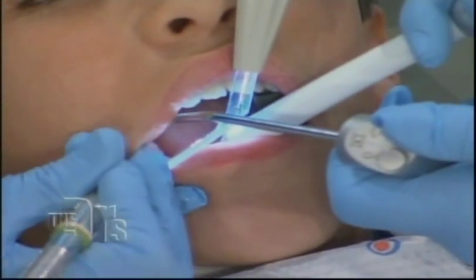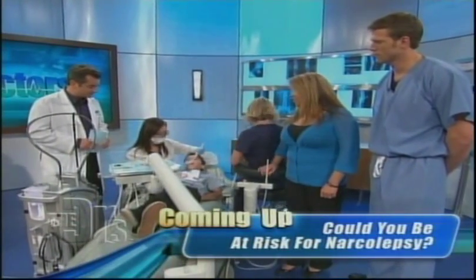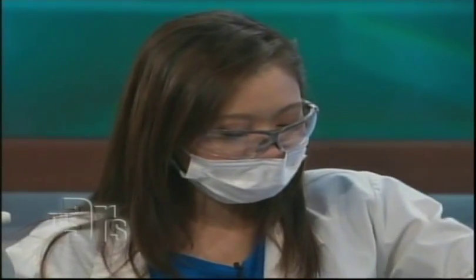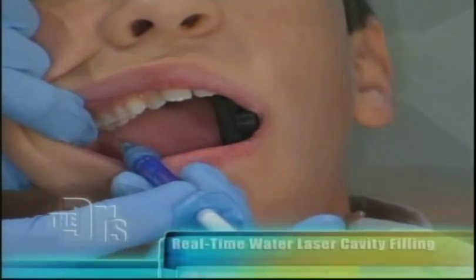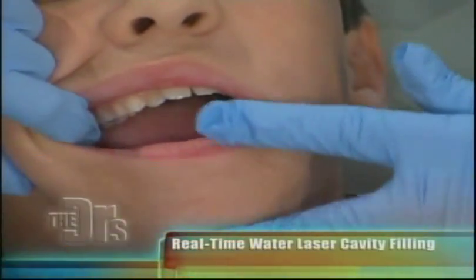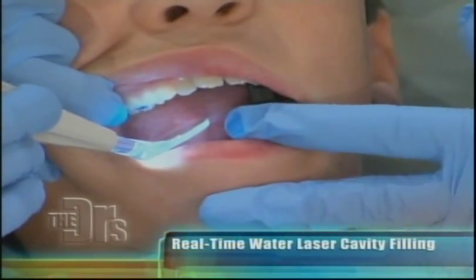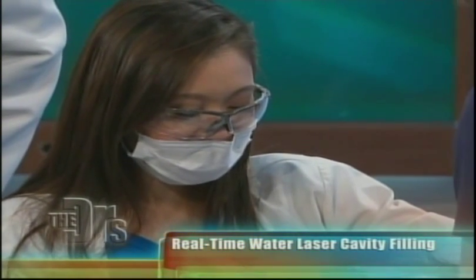Okay, so all the cavity is gone — now I have a rock-solid hard tooth. Now we're halfway done. The bad part's gone, and now we have to seal it. This is the easiest part. So Zach, we're going to paint your tooth in four different layers. First, we're going to use a material called etch. Etch is like a soap that cleans off the tooth, which sterilizes the area so your cavity filling is going to last you a lifetime. We leave the etch on just for a few seconds and then rinse.